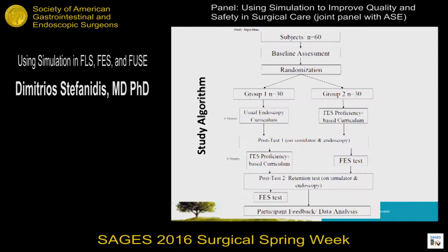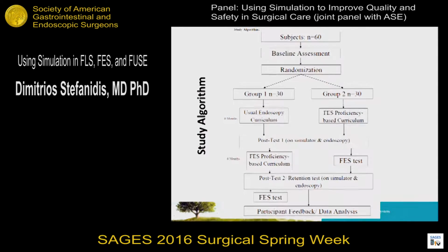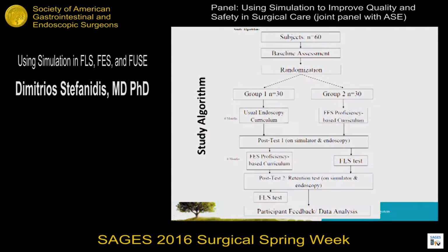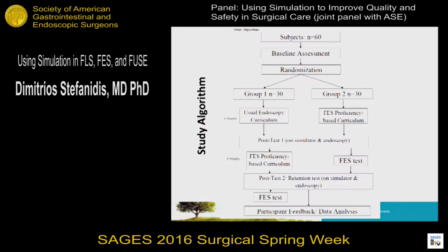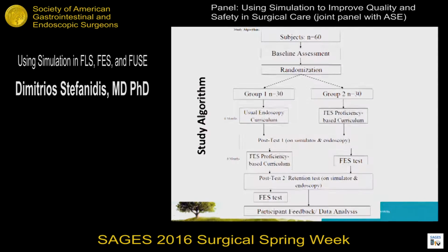At North Carolina, we do have a study going on where we are currently enrolling residents, have enrolled residents in all our training programs, and we're generating a curriculum for the fundamentals of endoscopic surgery using the FES test as an assessment tool at the end, but also obtaining clinical evaluations. That will give us some additional information of how to better do this.